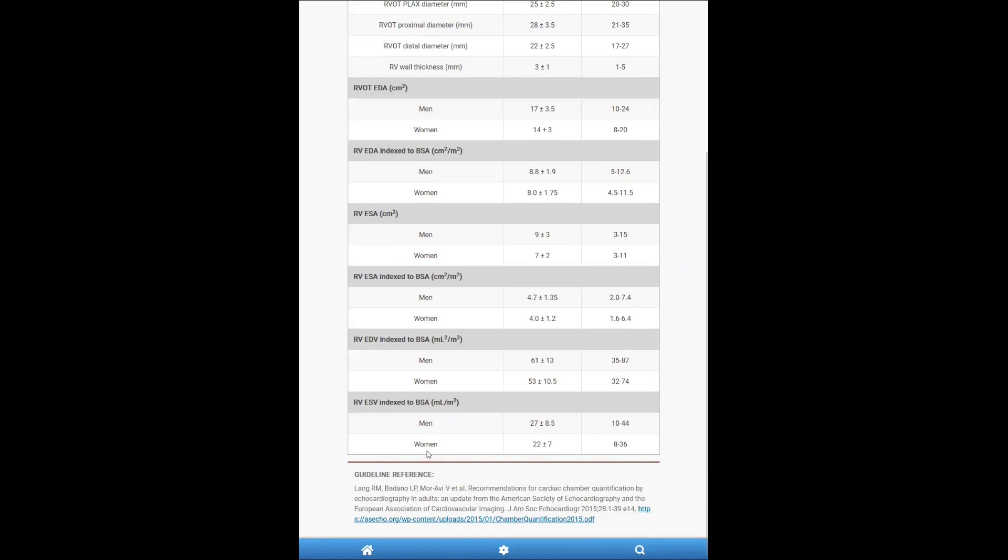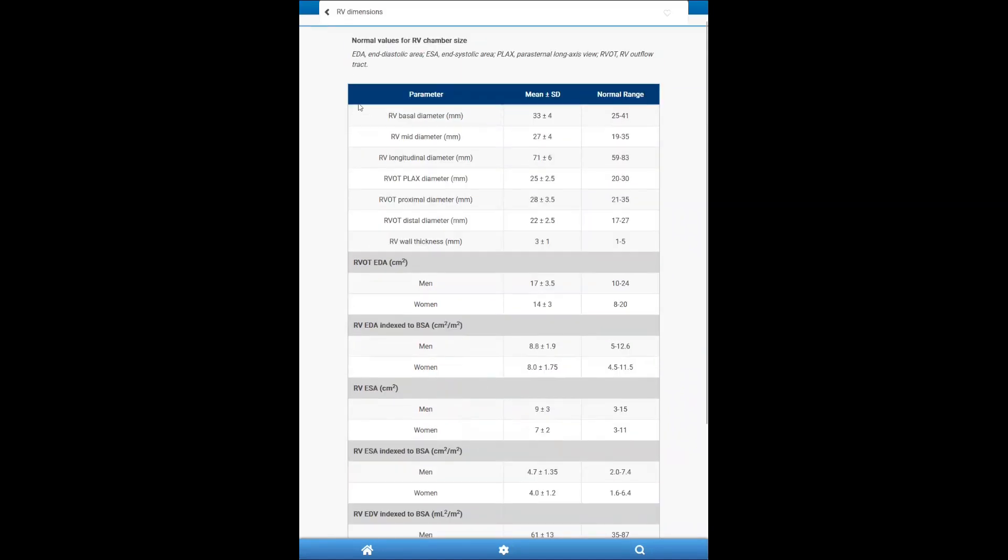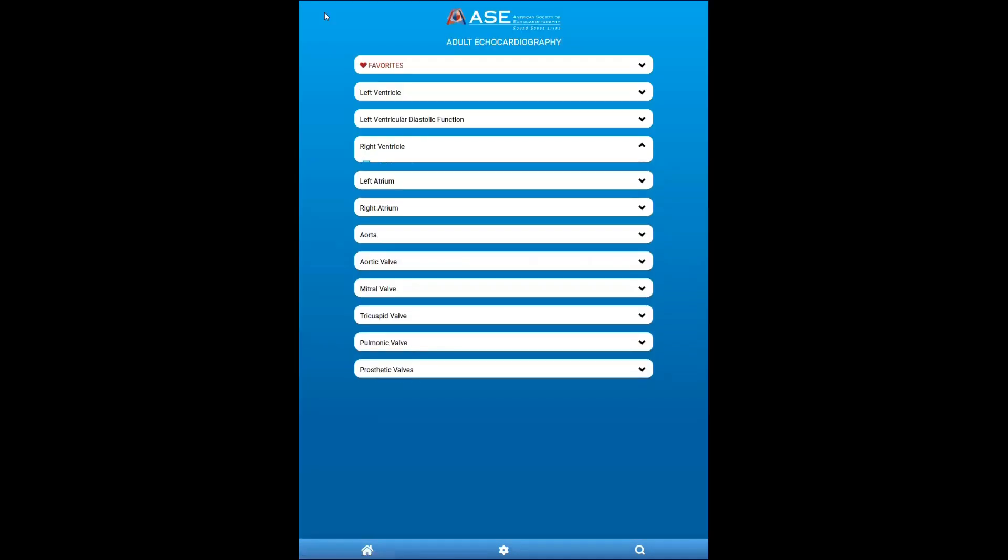So this, for example, is the chamber quantification guideline from 2015. I can go back to the home section by putting this button or just press the back arrow.